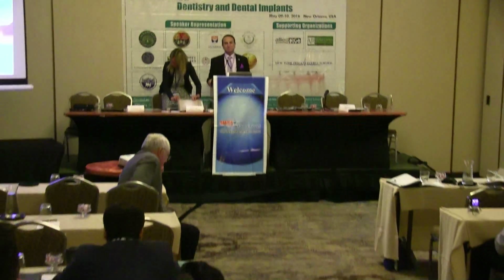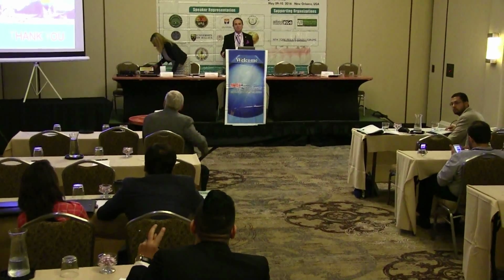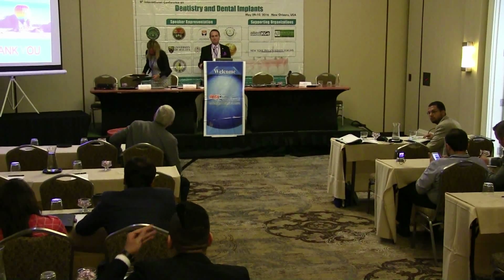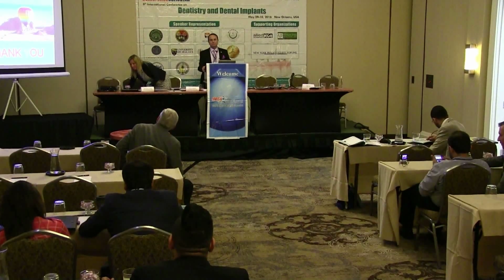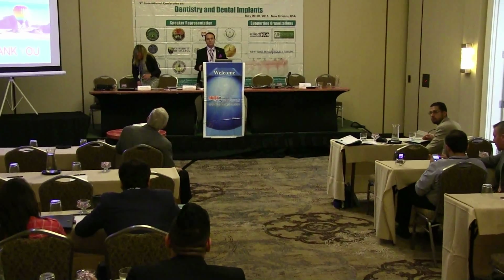First of all, thanks, doctor, for this presentation. I have two questions. The first one is about case number 10, the gummy smile. You placed 2 micro implants to do an intrusion for the incisors. Can we use RCS for it, or is there a contraindication?